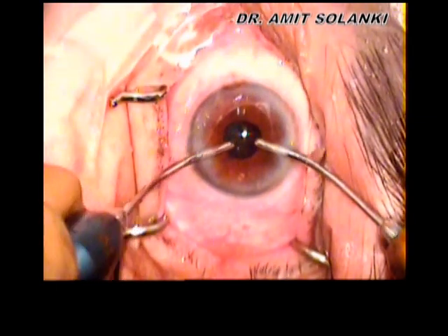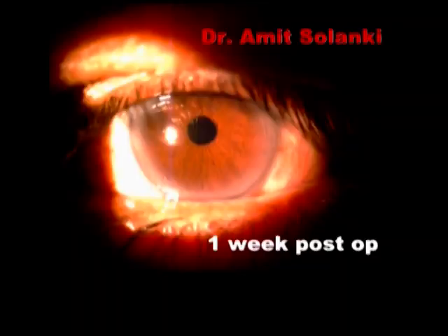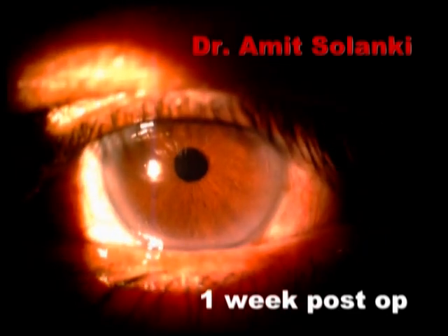Using the no-hooks, no-rings technique, you can achieve a perfect round and normally reacting pupil in the postoperative period.